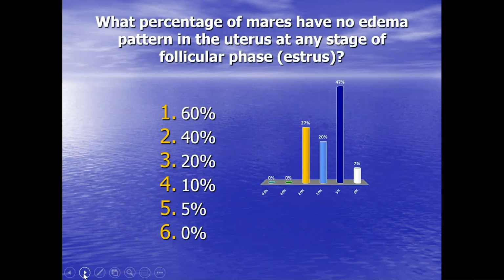Now, I don't know if these mares trouble you. They certainly can trouble me. They're a mare which, throughout the follicular phase, develop no endometrial edema pattern. So I asked people, what percentage of mares have no edema pattern in the uterus at any stage of the follicular phase?